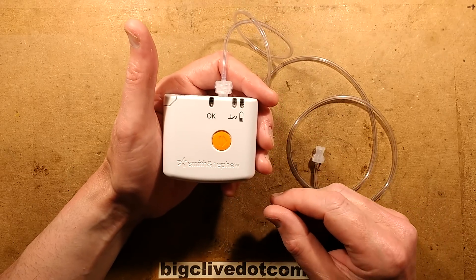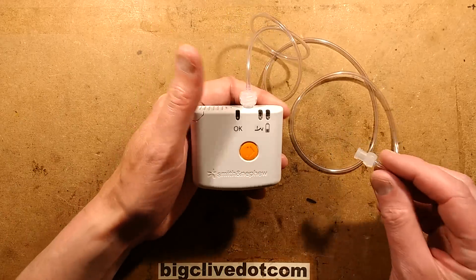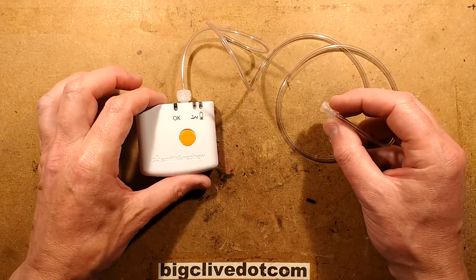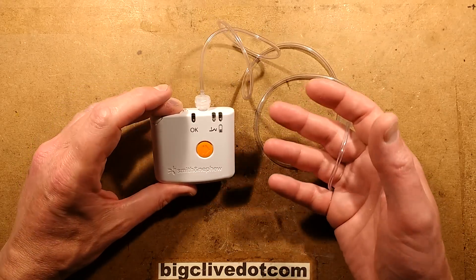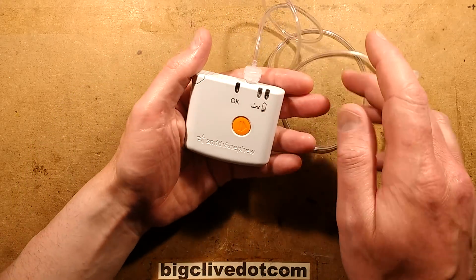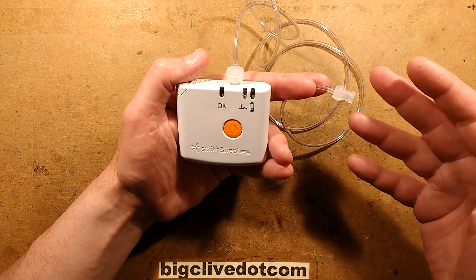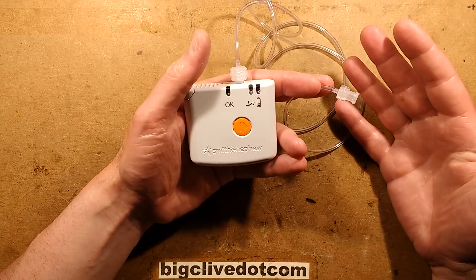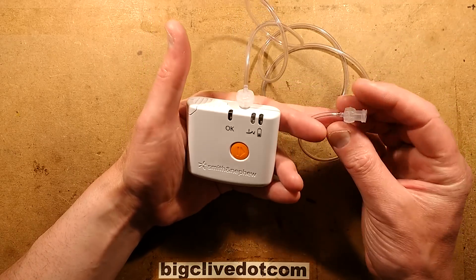This is a rather interesting medical device - and also a slightly squirmy one - because its function is to couple onto dressings and apply negative pressure. It's got a little vacuum pump in it and it physically sucks your wounds. The logic behind that is that if you apply negative pressure, bacteria can't get into the wound - it's always going to ooze outward and therefore stay sterile.